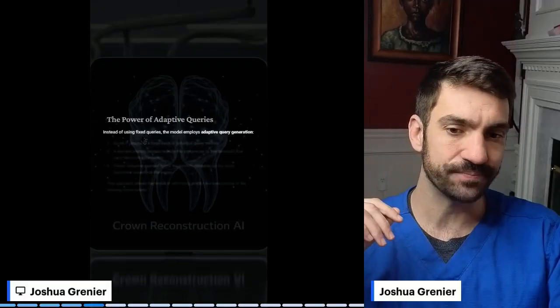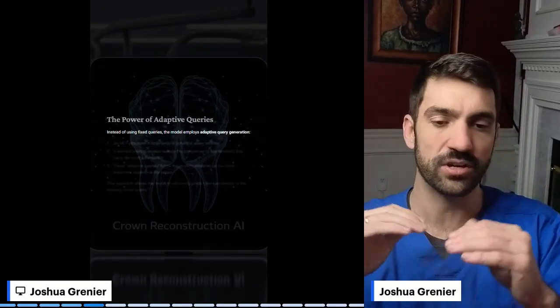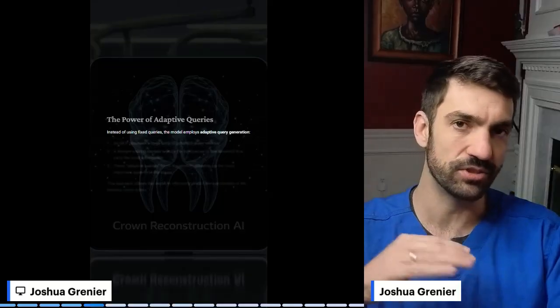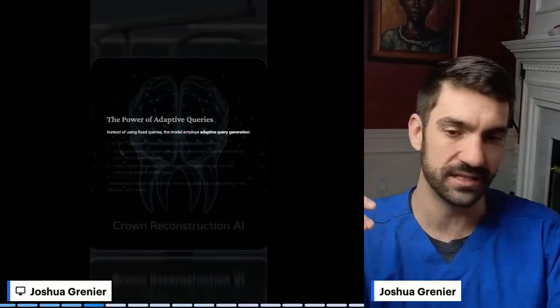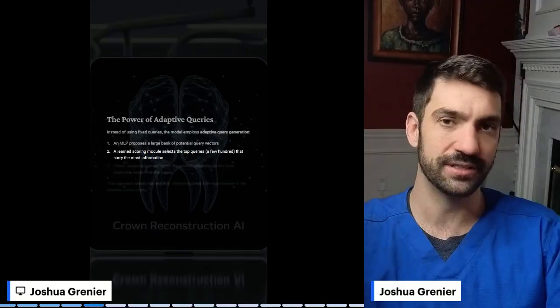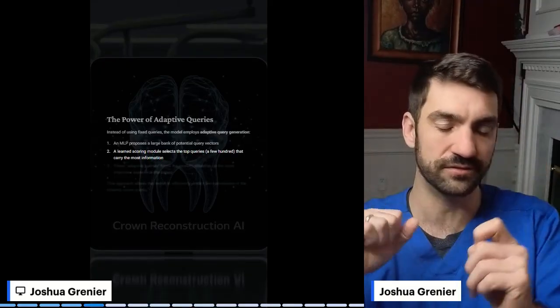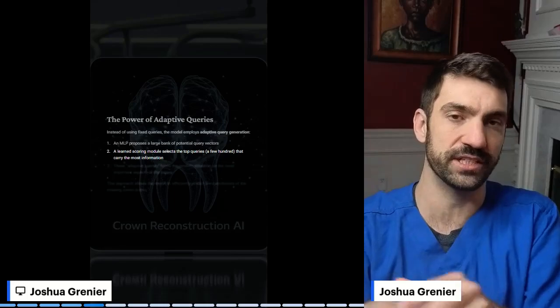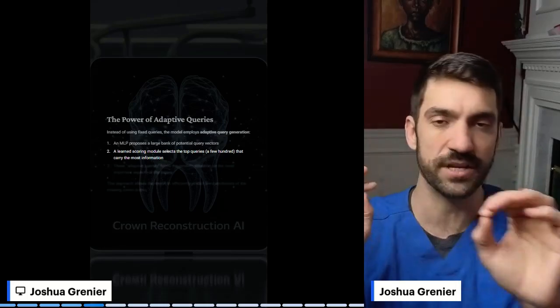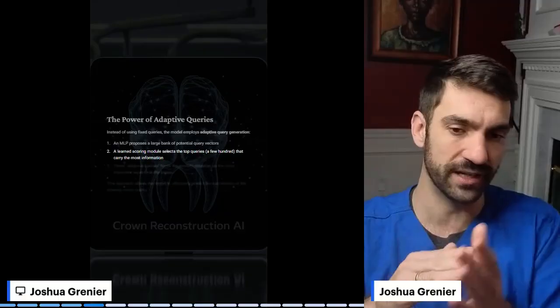And finally, those queries, those questions it asks, are not fixed. They do continue to change. This is going through many different cycles. And the multi-layer perceptron is essentially a data bank, which can be thought of as almost a pinball machine, where the bits of data or their matrices are able to change their values and spit out a new vector, a new direction.